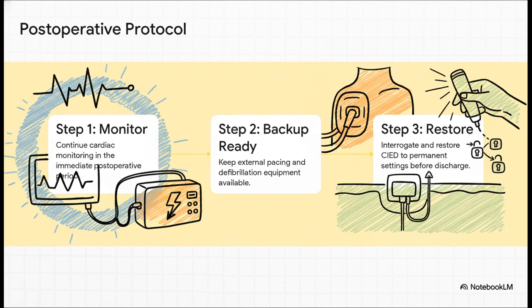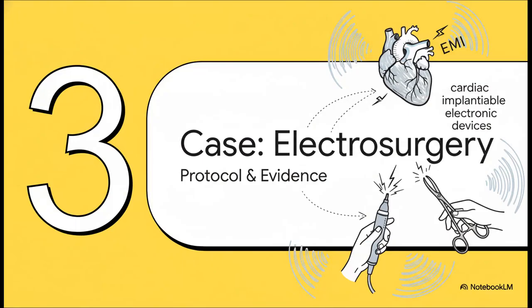Let me be really clear. Sending a patient to the floor with their ICD therapy still turned off is a huge safety event. It just can't happen. Okay, theory's one thing, but let's see how this all stacks up in the real world. We're going to dive into our first case study, which focuses on that really common problem of electrosurgery and EMI risk.